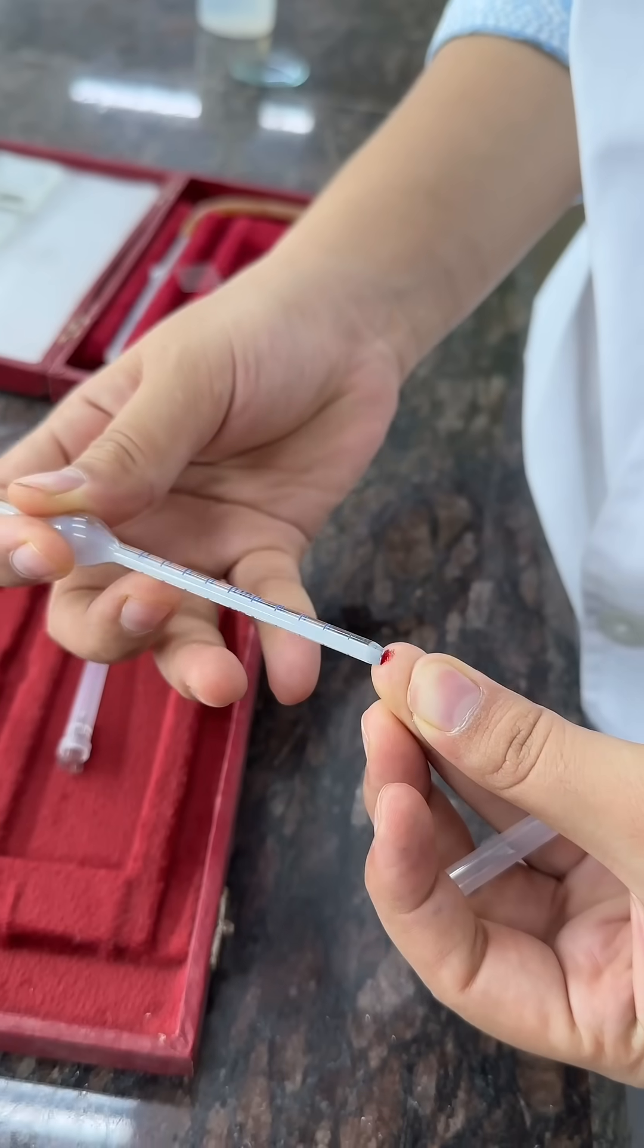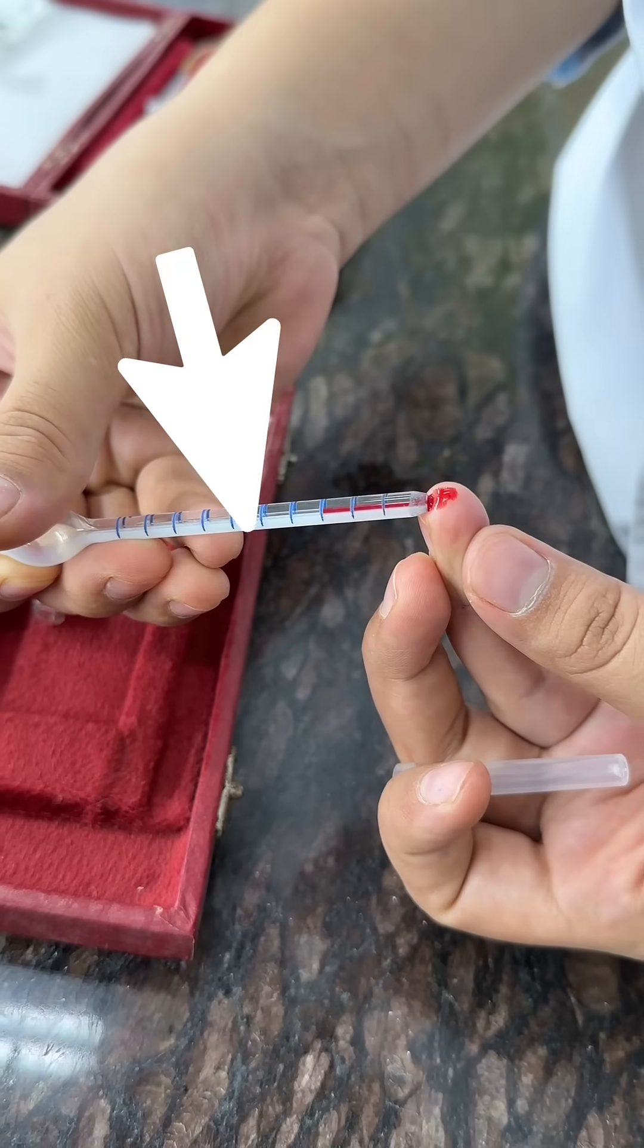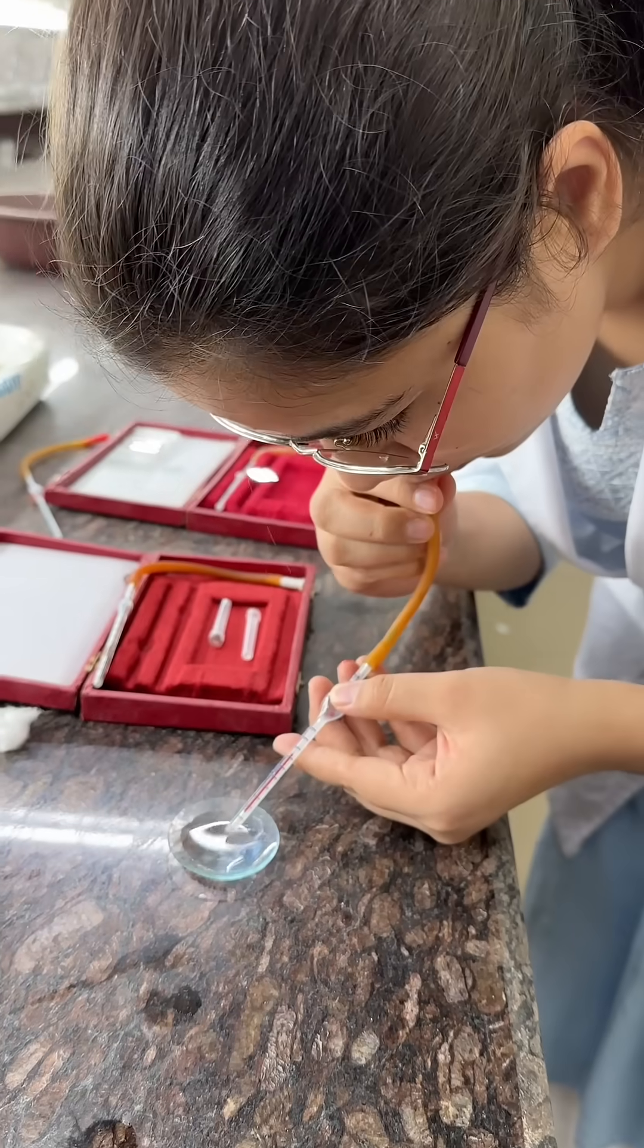Then pricking the finger to fill the blood in RBC pipette up to 0.5 mark. Now suck Haem's fluid in pipette up to mark 101.